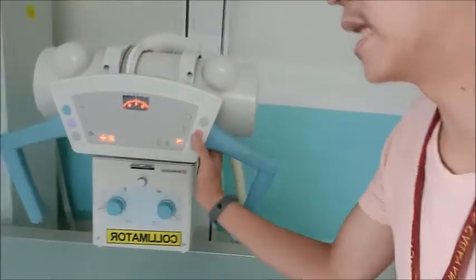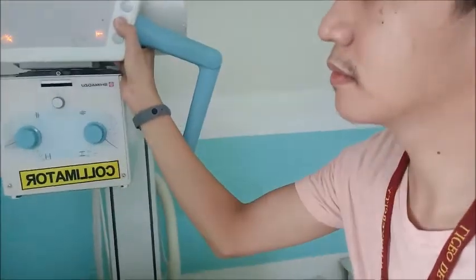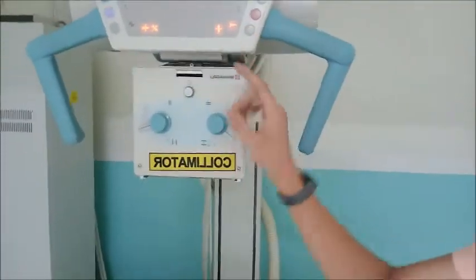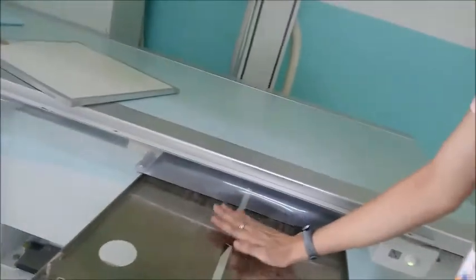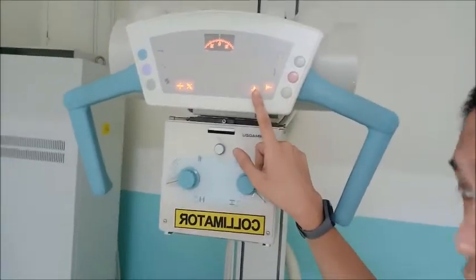And the other 72 is for the lateral of the neck, the lateral of the cervical bodies. Okay, that is 40 SID, from the source towards our receptor, which will be placed on the table. Okay, 40. That is 40 SID.